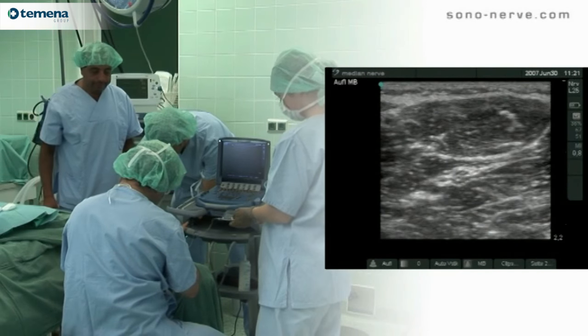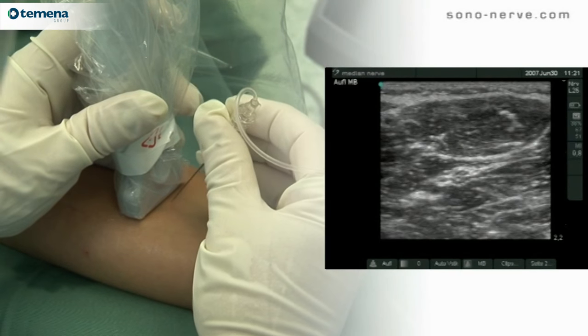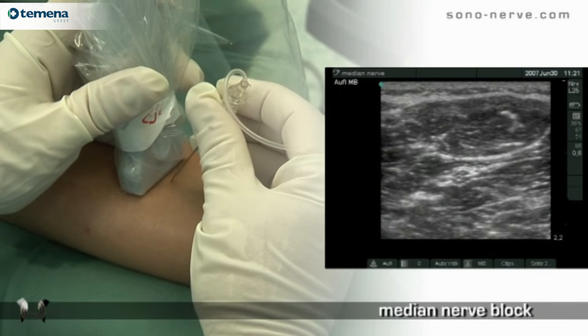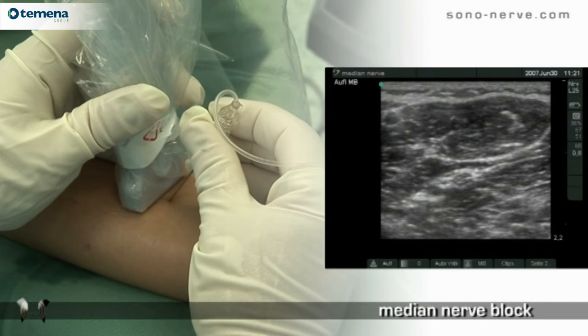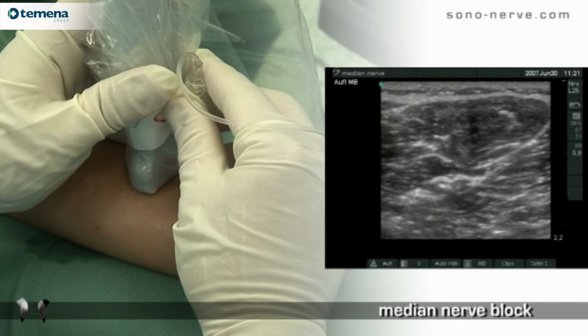We use a 25mm linear probe at high frequency, 13 MHz. This block can be performed with an in-plane or out-of-plane technique. We illustrate an out-of-plane technique.